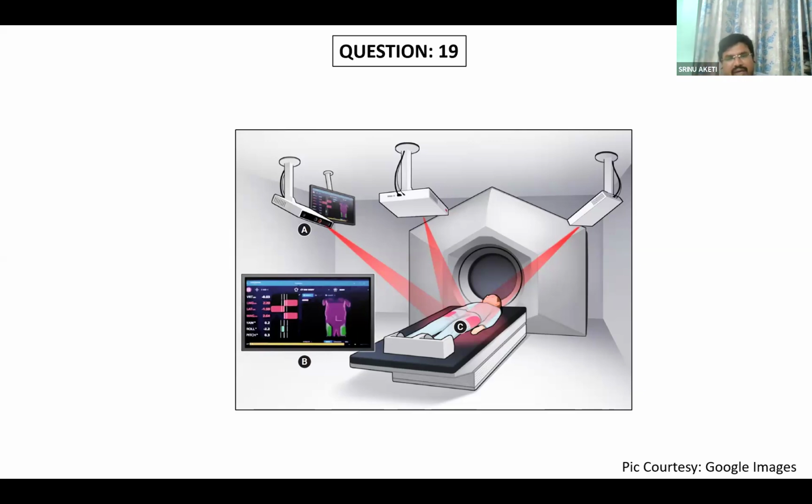Okay, it's a complementary one. It is an extra help because for some patients you need not have masks. Easy setup. You can easily set up, and you can monitor the patient throughout the treatment. The daily intrafractional monitoring is possible. You can do some gating also, but the main disadvantage is you are matching externally, but we don't know internally whether it is matched or not.